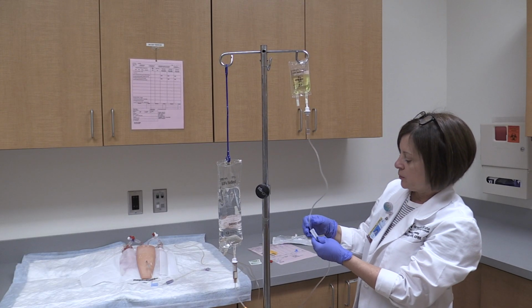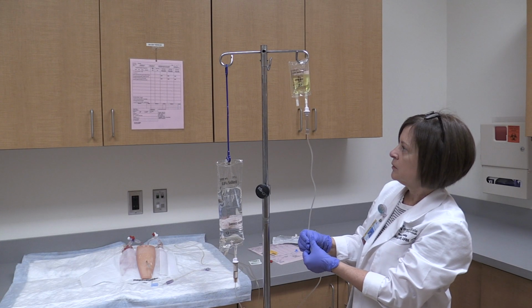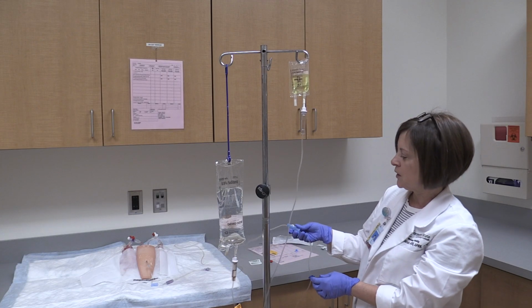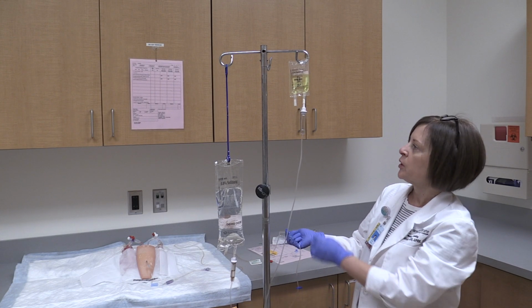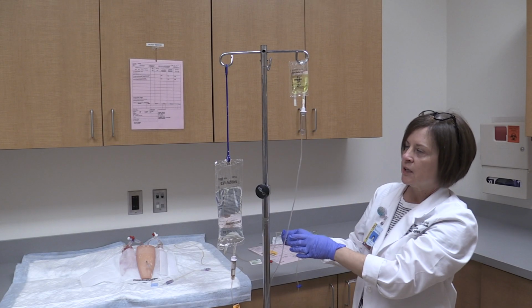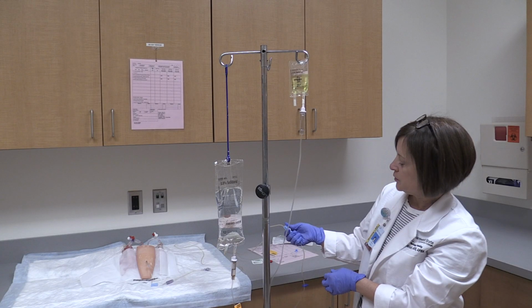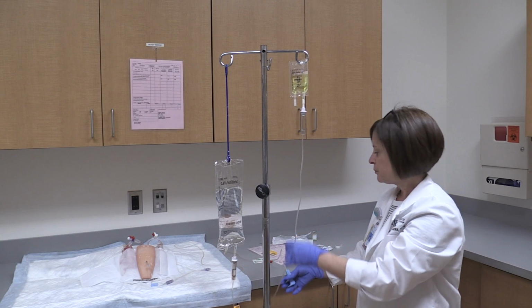At this point, we can then open up the secondary and we will calculate the drip rate by using the clamp on the primary. When you do this, you want to make sure you're looking here because this is what's going to be dripping. These are the drips that you are going to count to get that drip factor correct. So you'll alter the clamp down here on the primary, but watch the secondary.